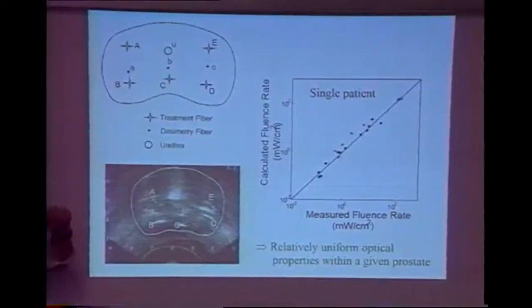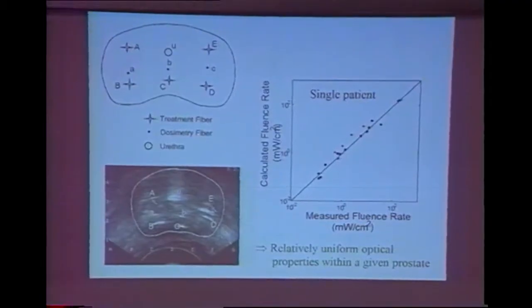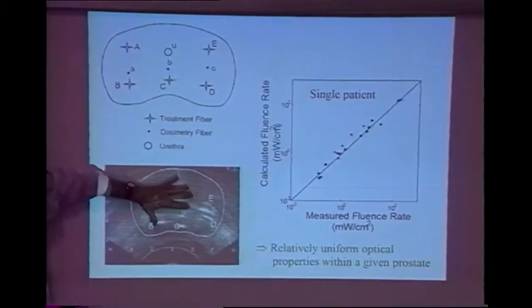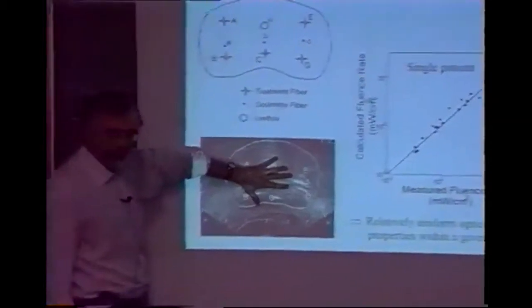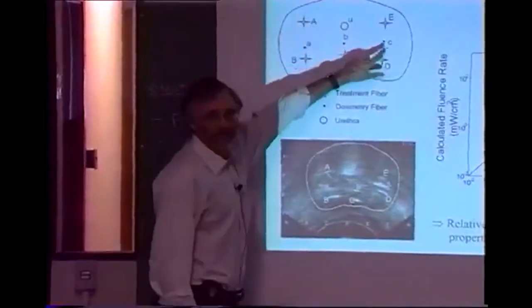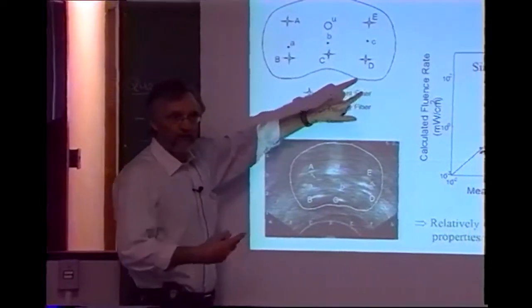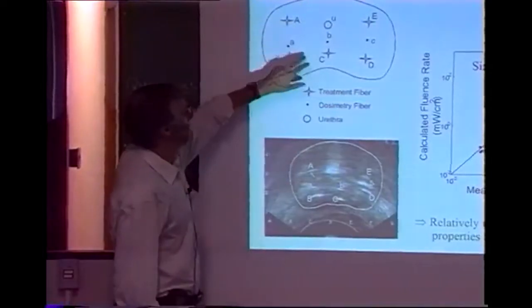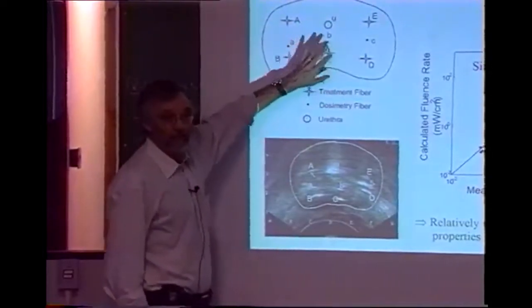Don't you do it like in brachytherapy? So you try to put the intensity, so overall illumination. Right. So what happens is that the treatment is pre-planned. So we plan the position of these fibers and the amount of light to give a uniform distribution. But then we have to check that and confirm that with the individual patient.